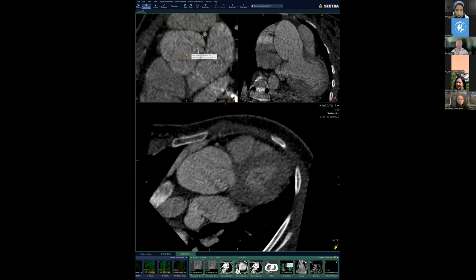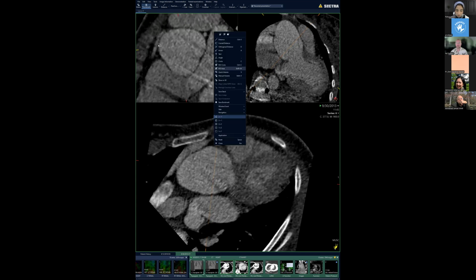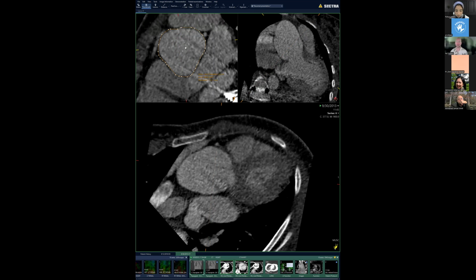And I will actually say that the American Heart Association guidelines with patients that have bicuspid valve actually would suggest that you should measure the root area. So if the patient also happens to have a bicuspid valve, you have to measure the area of the root or the cross-sectional area of the ascending aorta that's dilated and report that, because the cardiologist will divide that by the patient's height in meters, and that's going to be the important number for deciding whether or not the patient needs surgery and when they need the surgery.